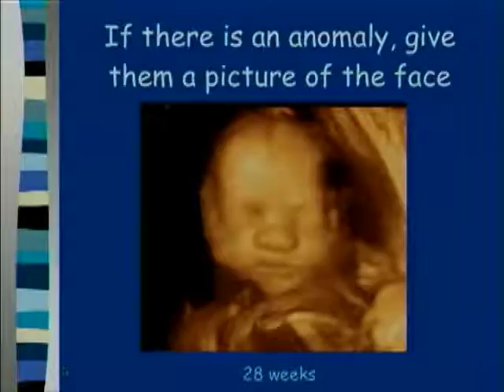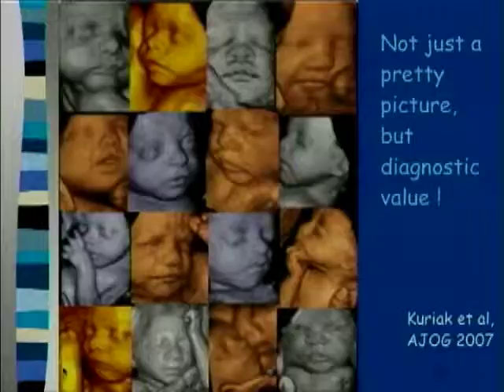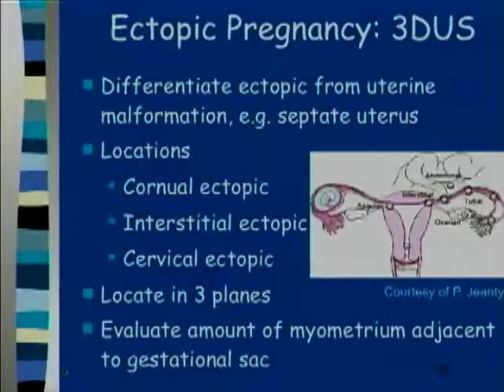If there is an anomaly, I think it's very helpful to give the family a picture of the face, because all of a sudden, many families have told me they stopped thinking about the club feet or the omphalocele when they realized there was a baby in there, and the face helped them kind of come to that. I think in our everyday practice, we show pictures of the face to parents all the time. It's what they want to see, and I think our pictures are getting better and better, and some days you'll get really great pictures and other days you won't, and it all depends upon the fetal lie.